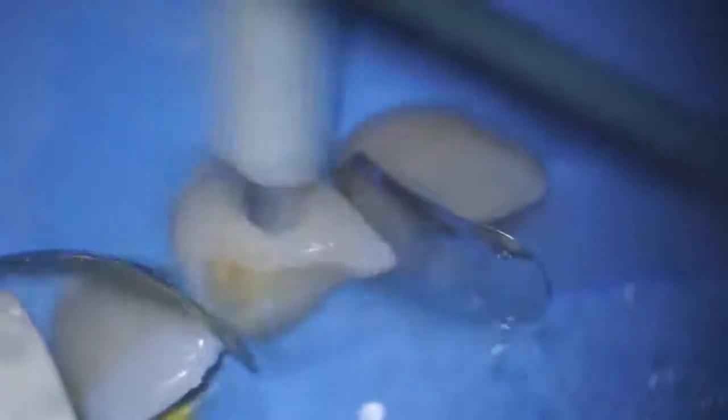Usually I use the method of dynamic etching. I just take some brush and start to mix the gel on dental tissues, and this particular approach can lead to an increase in micro roughness quality. This is the stage of washing off the acid gel with water. Then I remove all water excess with the reverse flow of air through the salivary ejector.